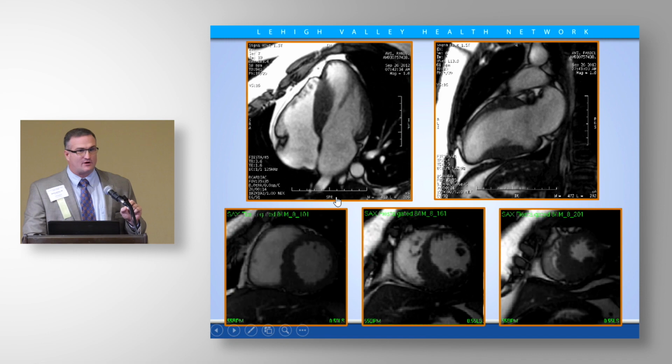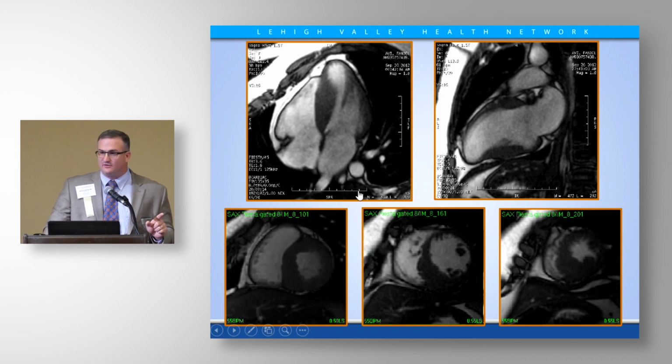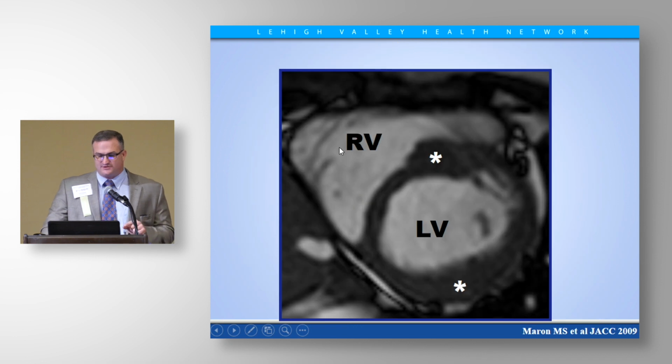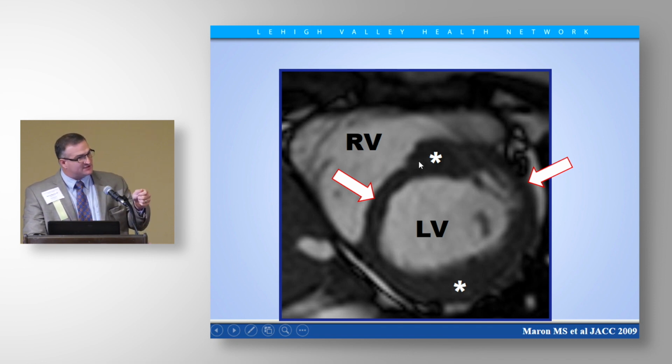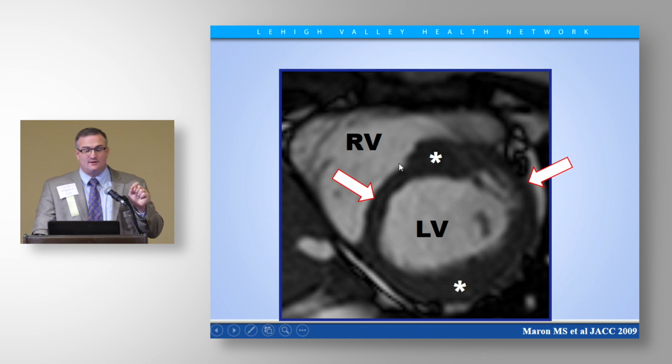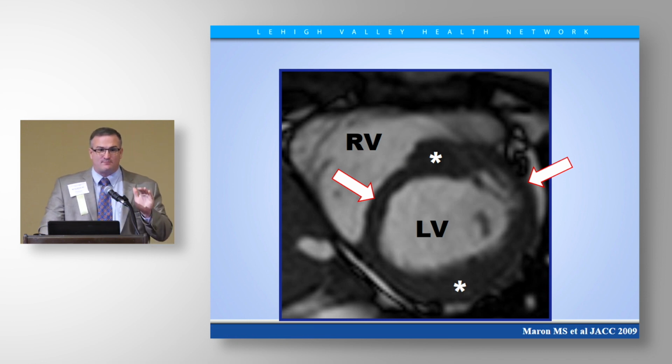Clearly hypertrophic cardiomyopathy, an entirely different view of the myocardium compared to the echo. And we know this. We heard this yesterday from David Owens, and there are multiple studies now showing that if you have normal muscle next to abnormal muscle, the sonographer may screen one way or the other and make the ventricle look normal, right? You can make an abnormal muscle look normal depending on how you slice through it with the echo. It's not perfect, neither is MRI, but we're able to get a better look at the entire ventricle in one single shot.